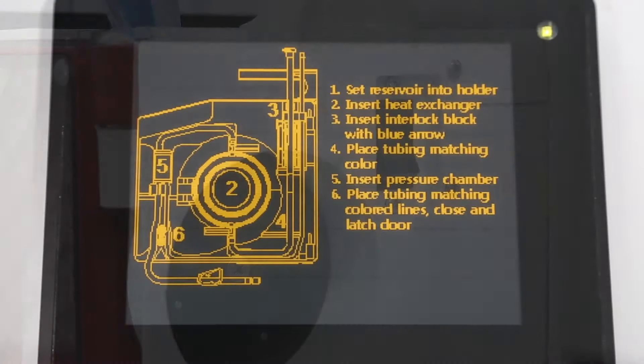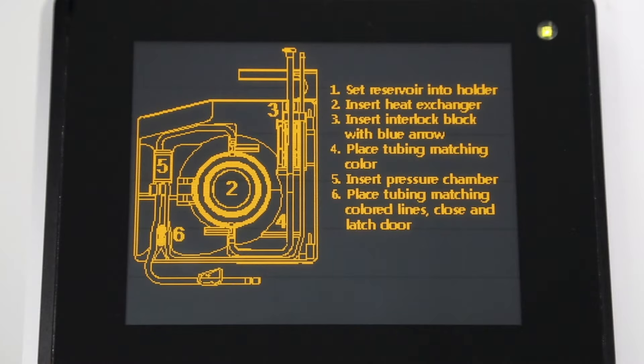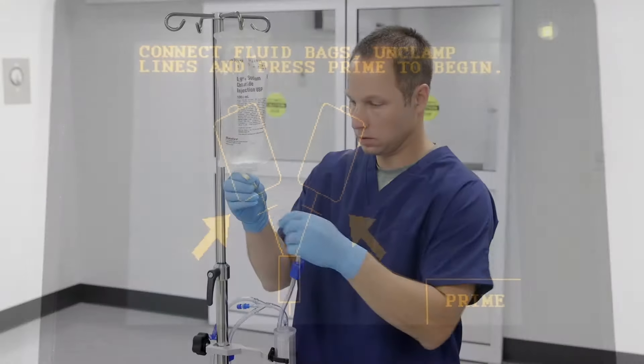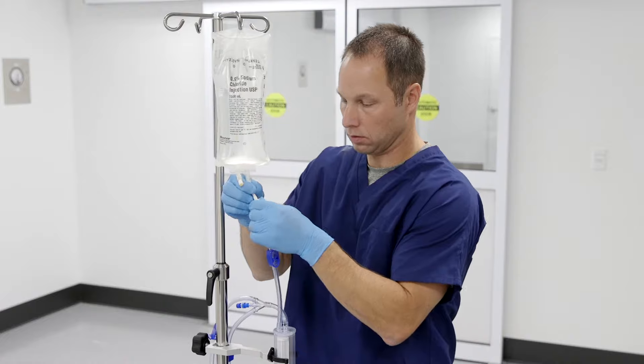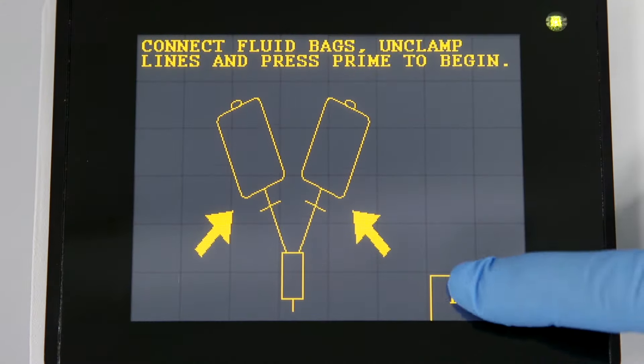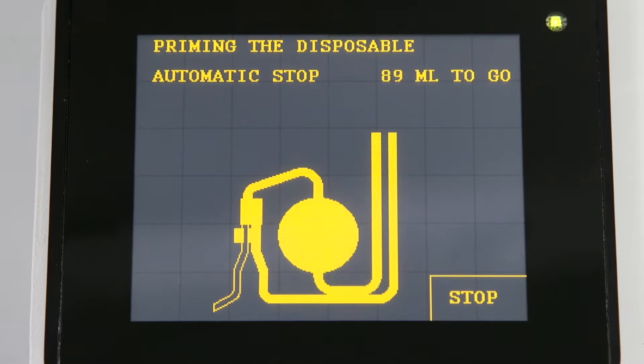When first switched on, the screen will display instructions for installing the disposable set. Press next to move to the prime screen. You will now be instructed to connect fluid bags and unclamp lines. When ready, press prime to begin priming the disposable circuit.